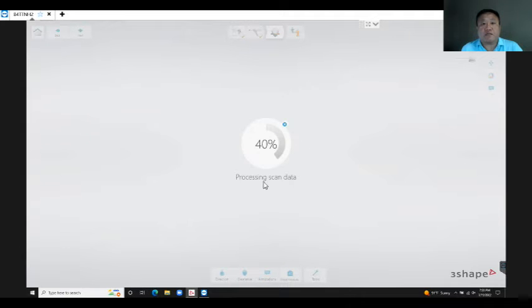Is there any question? I don't see any questions in the chat box right now, but I had a question. If you're struggling on acquiring data on the intaglio of the denture, for instance, can you still use the zoom feature to just pinpoint that particular area with greater success without over scanning everything else? You can always use the zoom. As of now, I think there's an issue with 3Shape.